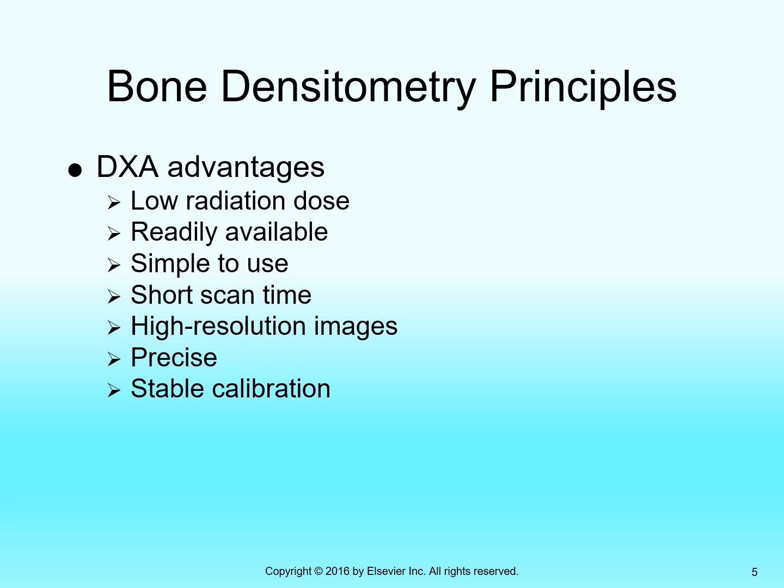So DEXA advantages: low radiation dose. We don't need to use as much radiation as a conventional X-ray beam. We actually use a pencil beam, so the beam is kind of shaped like a laser beam. The collimation is extremely tight, and it only goes through a circle probably a centimeter or two in radius. So the entrance side is probably 1 centimeter across, and the exit side 2 to 3 centimeters across, because the beam does expand as it travels through space and through the patient.